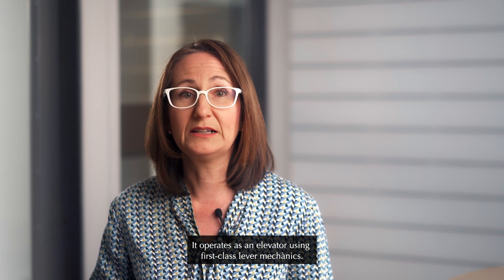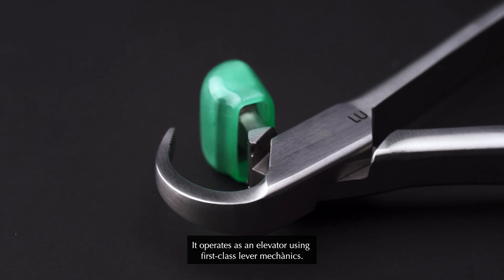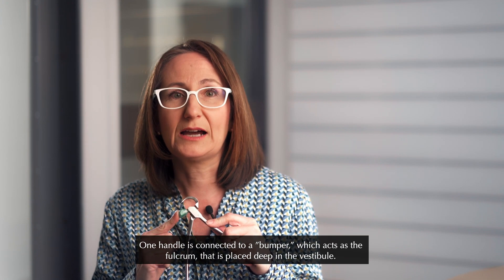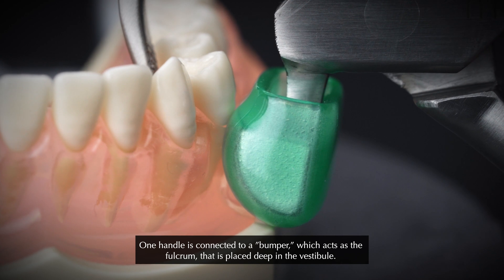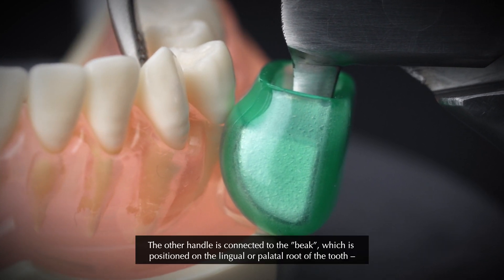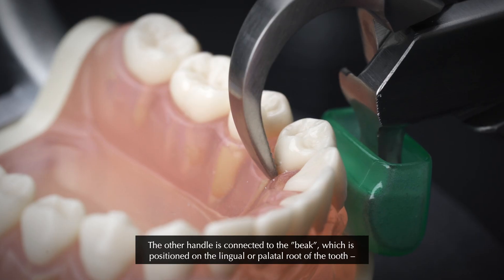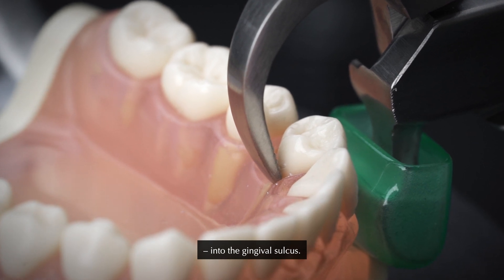It operates as an elevator using first-class lever mechanics. One handle is connected to a bumper, which acts as the fulcrum that is placed deep in the vestibule. The other handle is connected to the beak, which is positioned on the lingual or palatal root of the tooth into the gingival sulcus.